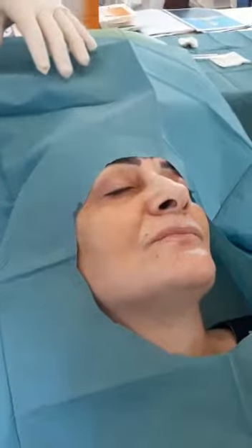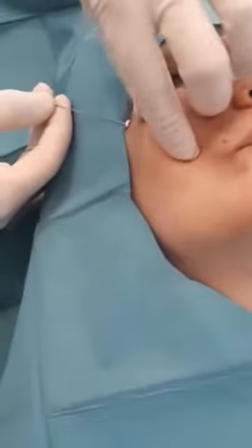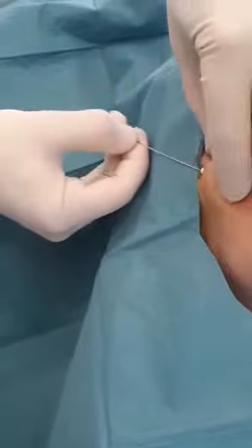Here we are. Then how many threads? 5 in this pack. Each two, each side. Then you choose just 5 in this pack, yes. Okay. This is soft. Did you have five? Okay, you rotate. You must grab the tissue you're rotating. That's the effect you want to have.